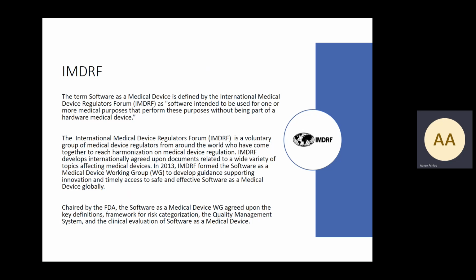I think they're also useful as supplementary documents to 62304. Sometimes if you look at 62304 and the IMDRF documents, there can be some confusion, specifically with the risk categorization document, but I think it's definitely worthwhile having a look at these documents. And the quality management system document is probably quite useful because 62304 doesn't really give you much advice on implementation in your QMS from a software perspective. And then also clinical evaluation is quite useful, although there are European guidelines for CE marking, which the MDCG guidance documents also provide further information on.